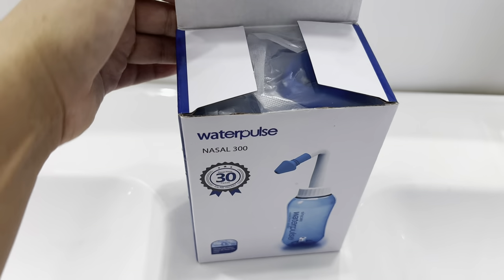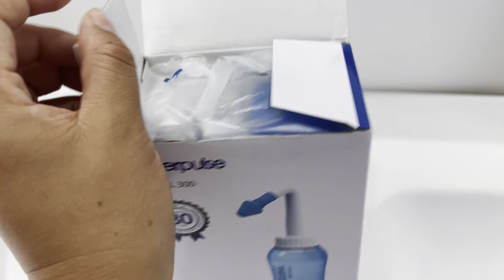Hi everybody! If you're watching this video because you have a congested nose and your sinuses are full, this time I'm going to try this nasal wash bottle. I got this one from Amazon, so let's give it a try and see if it works. This is what comes inside.